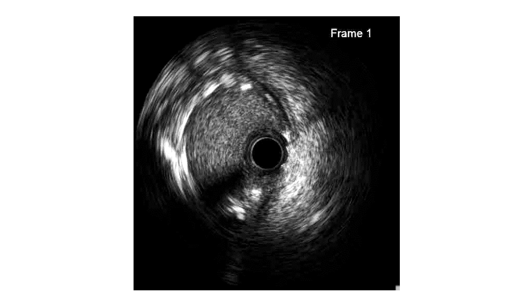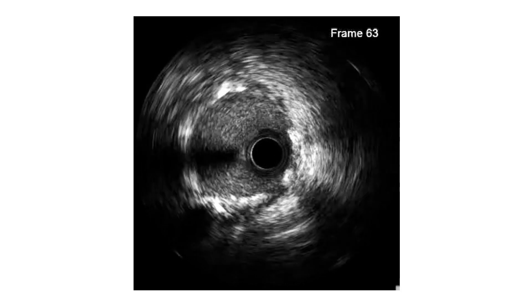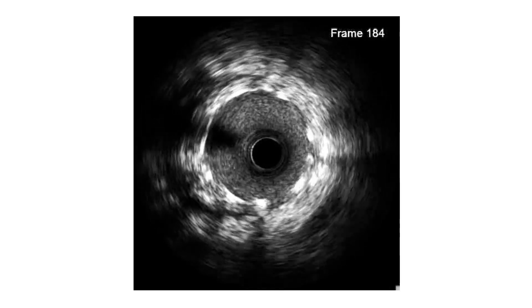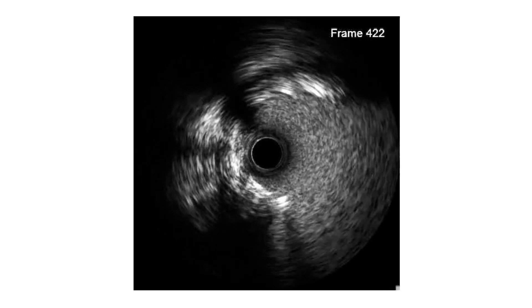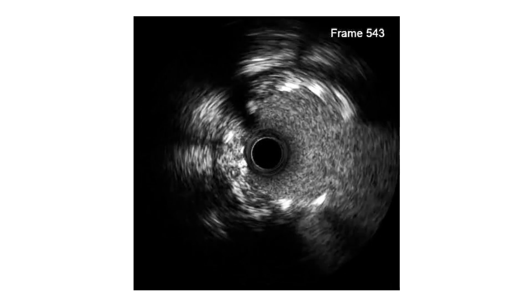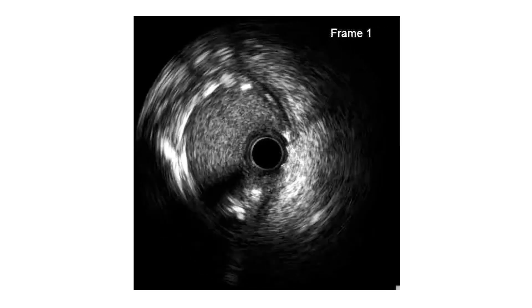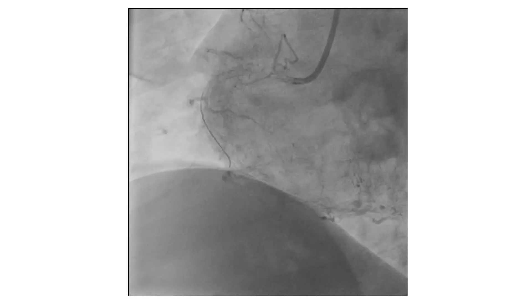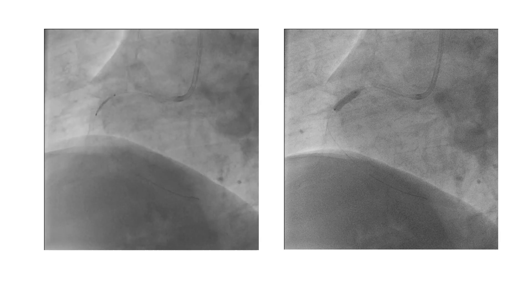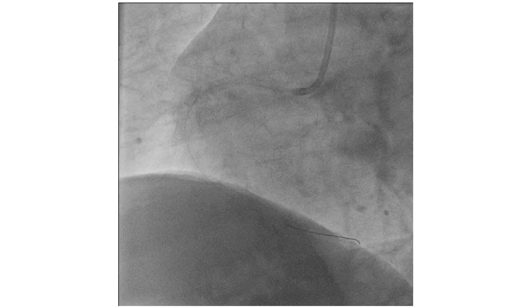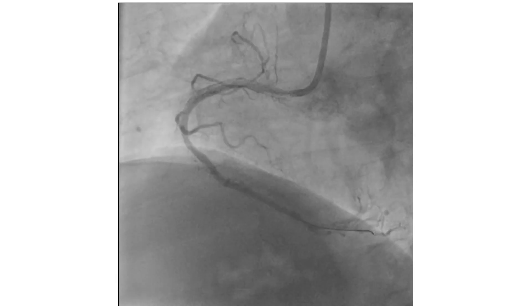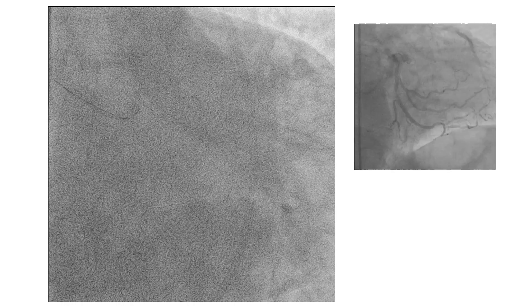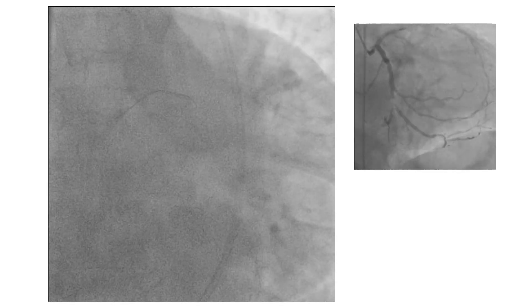A stent 3.5 by 30mm was deployed and inflated to higher pressure, then post-dilated to higher pressure with ostial flaring. IVUS was repeated and showed good stent expansion and apposition, and most importantly good ostial coverage — a single stent strut protruding into the aorta. We were unsure about the mid-lesion, so we did angiography, which cost an extra 4cc of contrast. We stented this part with overlap inflation.